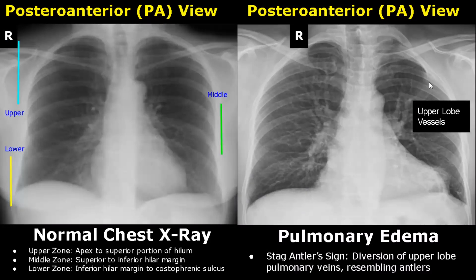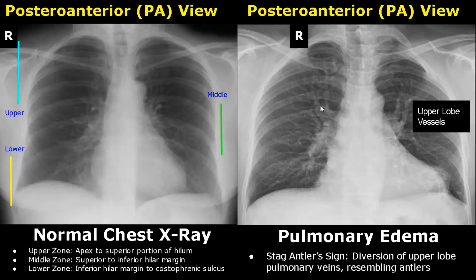Pulmonary edema is a condition in which there is fluid accumulation in the lungs' air sacs. It has a number of features on x-ray. One of them is the stag antlers sign, in which there is diversion of upper lobe pulmonary veins which resemble the antlers of a deer — that is why it is called the stag antlers sign. In the normal x-ray, we do not see such appearance.